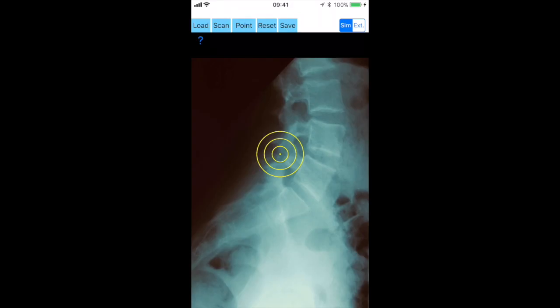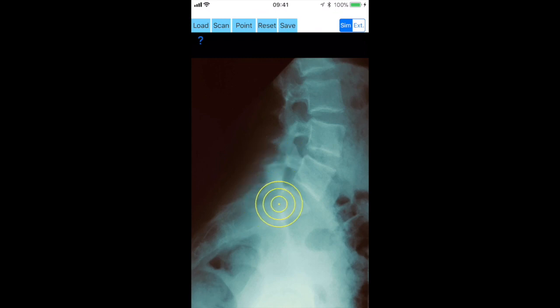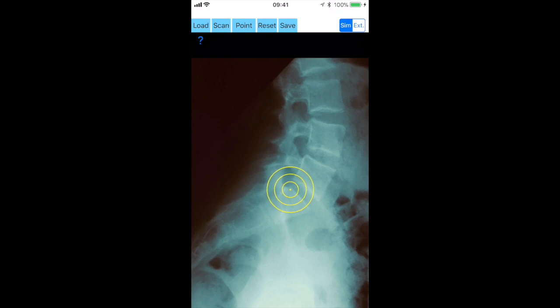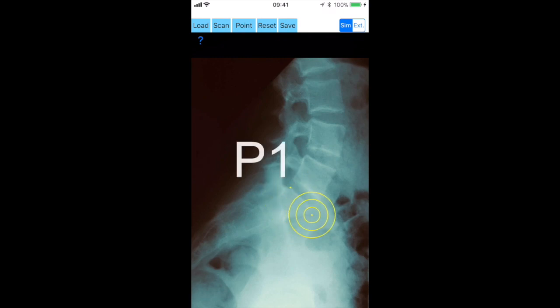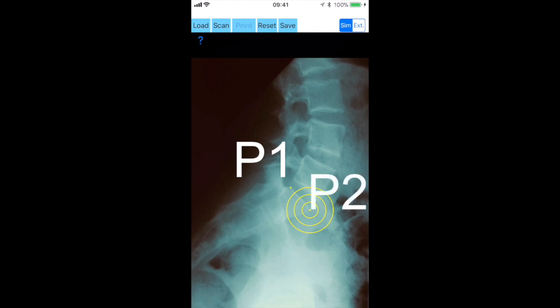Once you load or capture the patient's image, by default the simple method is highlighted. With the transparent circular template you aim to locate the posterior corner on the top margin of S1 of the sacrum, and by clicking the point button the point P1 is marked. By clicking the point button at the anterior corner of the superior end plate of S1 vertebra, the point P2 is marked.